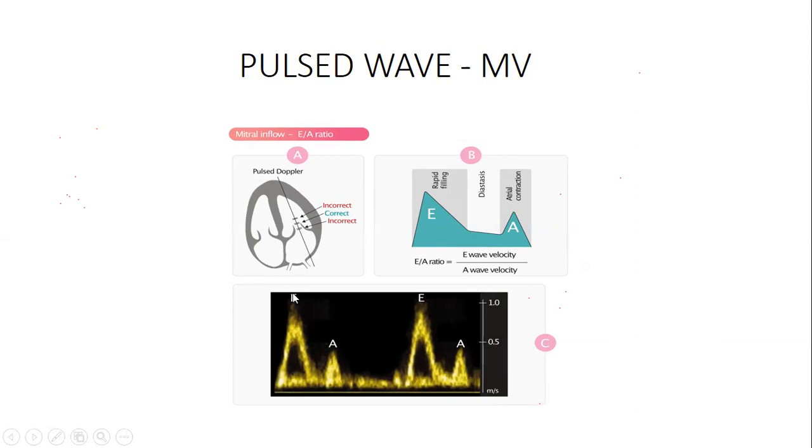Now, what is the E? E, you have to understand where it's coming from. I'll go back to the phases, the diastolic phases. These diastolic phases must also be understood. And you can only understand these diastolic phases when you know where they are coming from. And as long as you don't understand these diastolic phases, you keep making mistakes.